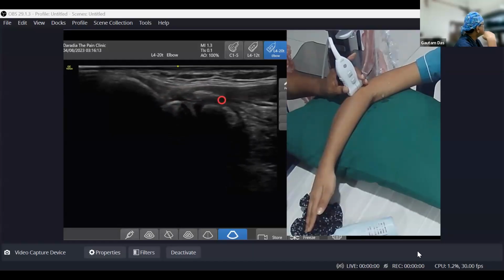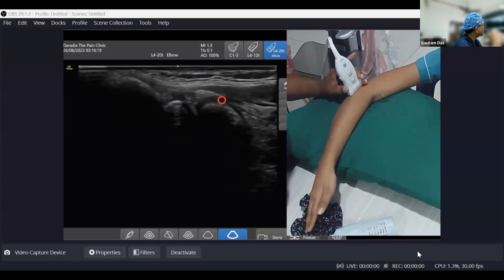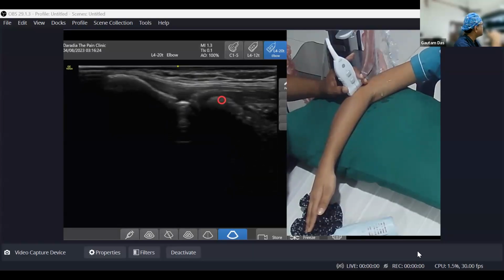Another thing you remember, tendon normally becomes more of a straight line. The fibrillar pattern is not lax, not sagging down, but ligament normally sags down when it is relaxed. When you are tensing it, then it is stressed, but otherwise ligament sags down. You always remember it.